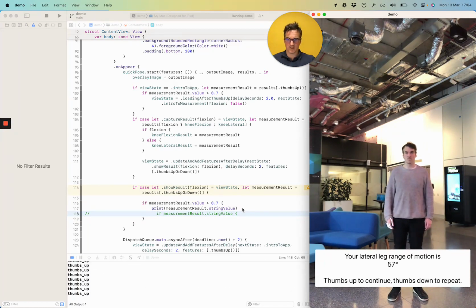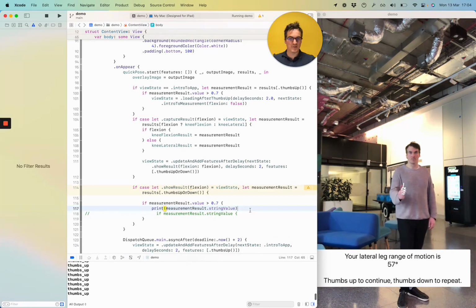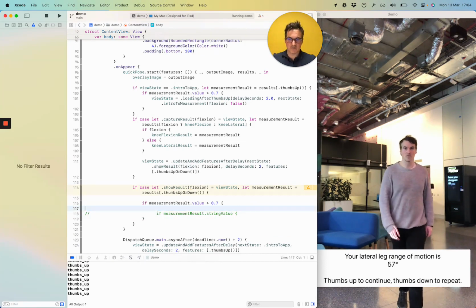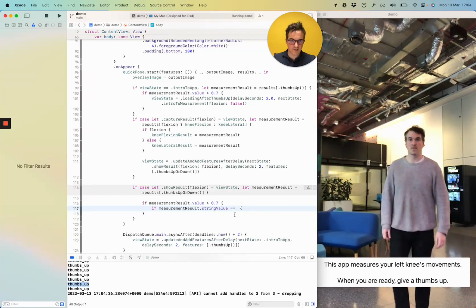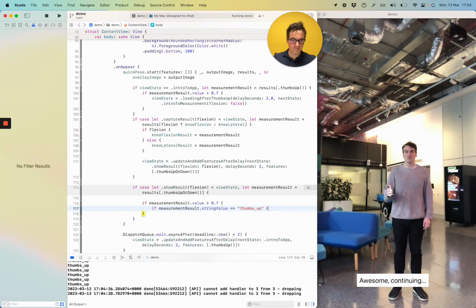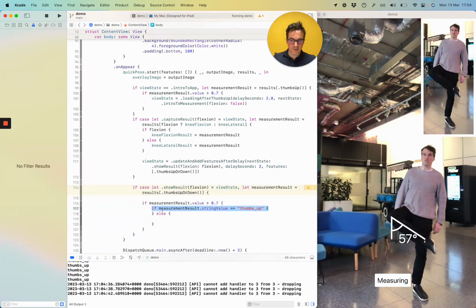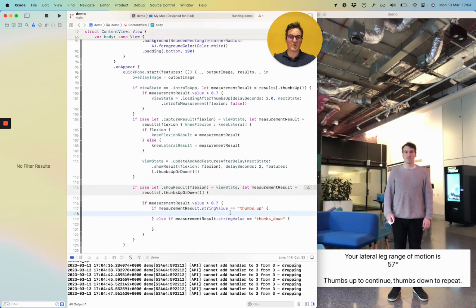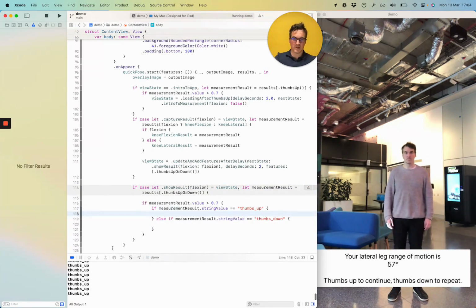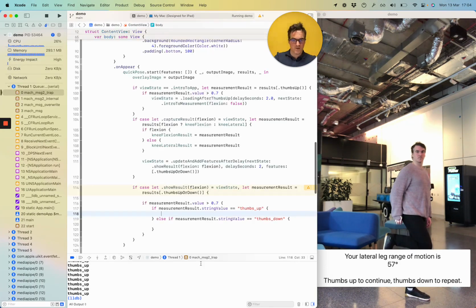Thumbs up, perfect. You might want to record a video where there's a thumbs down as well. I'm sort of leaving that to your own discretion. So string value equals, I'm just going to bring that out of the text, thumbs up. So if it's thumbs up, then we're going to do the first step, but if it's thumbs down, then we're going to do something else. If it's the other state, then we're going to do nothing. I'm just going to pause that for now. Okay.